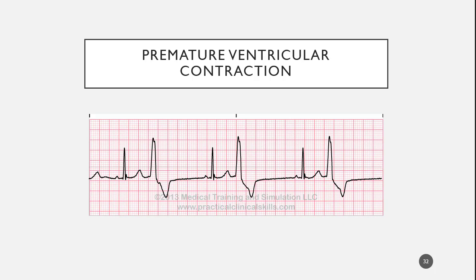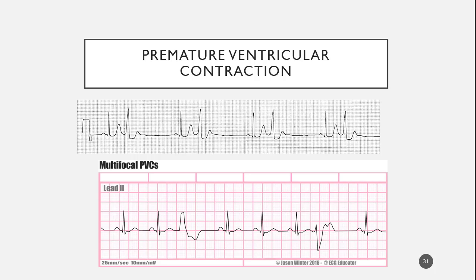The other thing I would want you to put in there is that the ectopics are unifocal, because that's really important. Remember, a patient that has this type of rhythm, we may get concerned about it, we may not. Especially if they've got a bunch of them or if they're looking different, we still may not get really uptight about it, but we're definitely going to watch our patient closer, assess them closer, and get a good history on our patient as well.